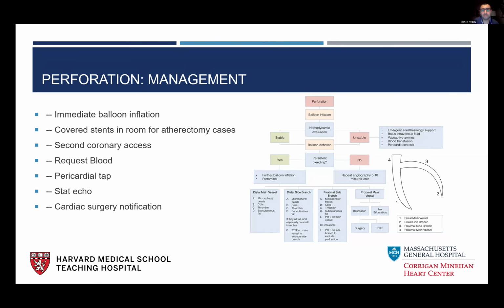Honestly, if the perforation happens right after atherectomy, it's different from regular balloons or anything. I think the covered stent would be the first thing to go at this point. And a few tips that I've recently learned: the Papyrus gets so difficult to deliver within calcium. So having a guideliner or guide extension ready would be very helpful in this situation, to protect your Papyrus from coming off and to help deliver it.